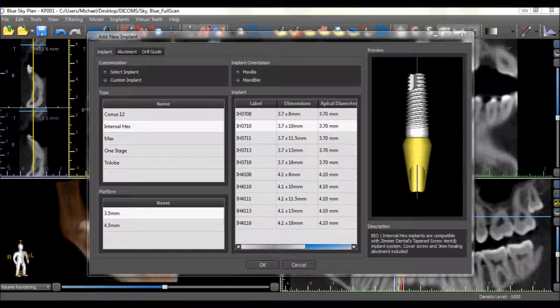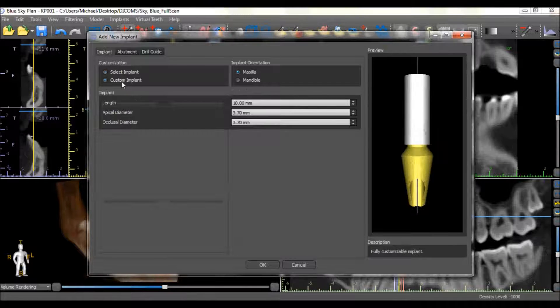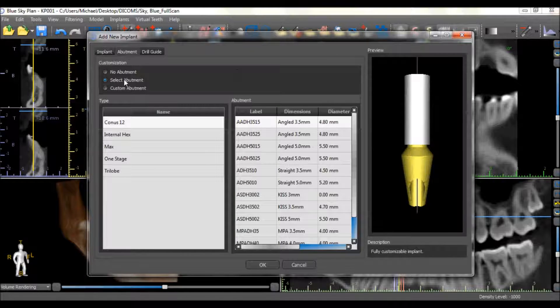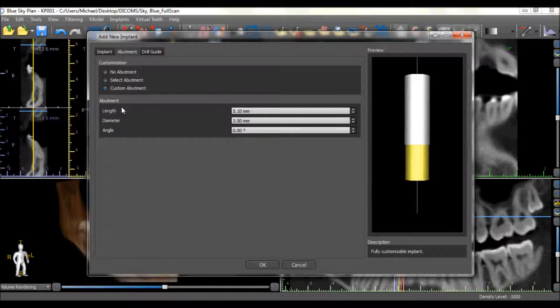If you would like to place an implant or abutment that does not show up on the list, select the Custom Implant option and enter the relevant dimensions. The same can be done for a custom abutment.